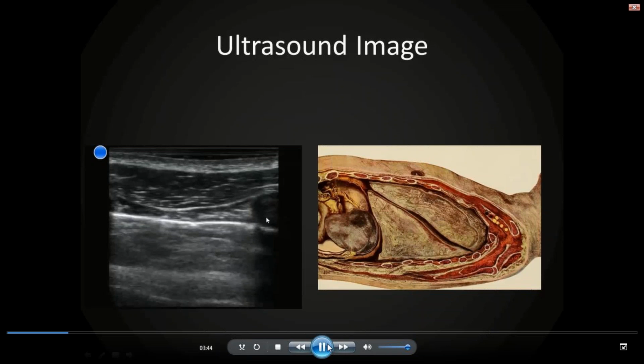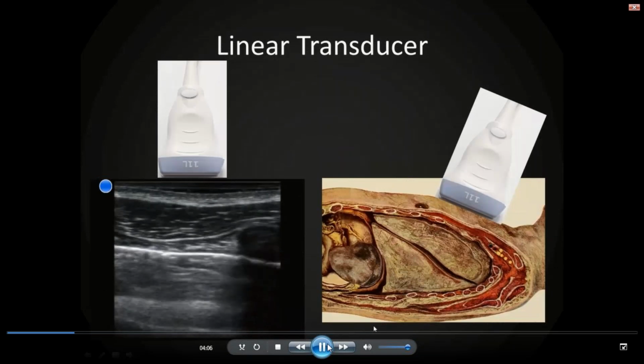This is a sagittal orientation. So we have an inferior rib and a superior rib. And just below it, we see the pleural line. Above it, some musculature. And this line is going to be repeated in many cases. In fact, we are starting to see a repeat right here. We don't actually see any useful clinical information below it. And that's commonplace. So how does this actually look?